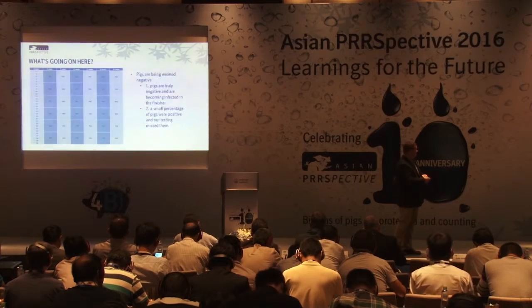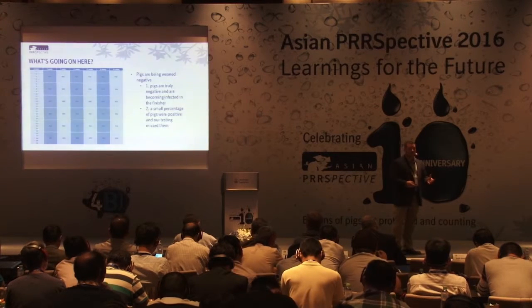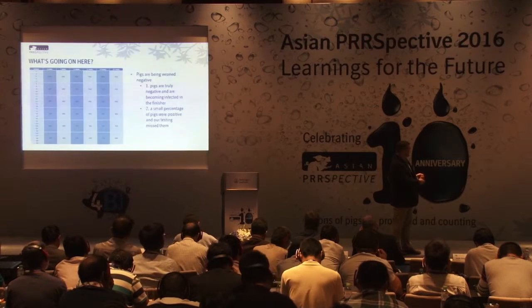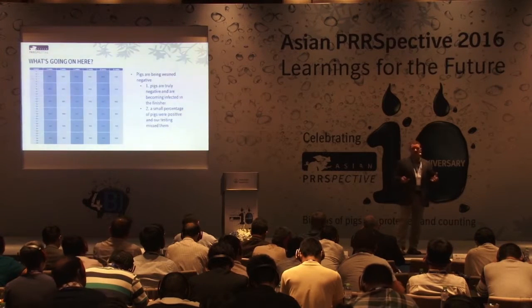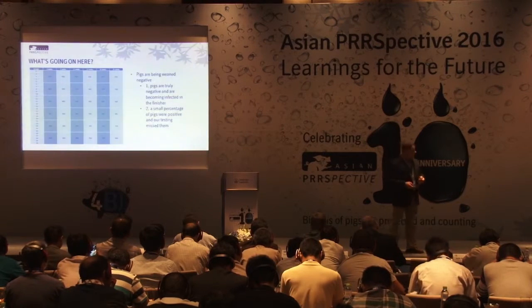We see here at 7 weeks, where we saw a dramatic drop in the percent positive and a drop in the average S/P ratio, we still have all negative PCR results. So all 6 of our pools are PCR negative. At weaning and 4 weeks later, we can't detect the virus in those pigs.